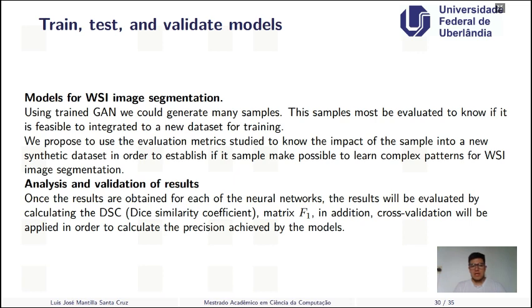Well, the model for WSI image segmentation, basically we are using GANs to generate new samples, and we are going to use a simple or common neural network for segmentation. But the most interesting part is the generation and evaluation of this data.